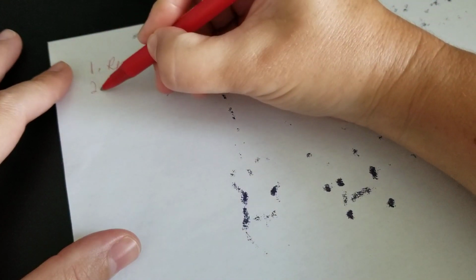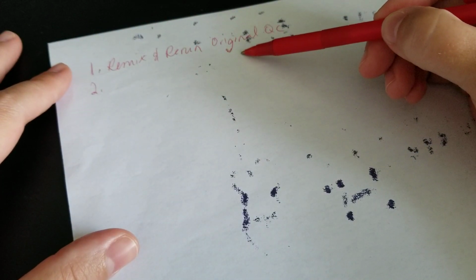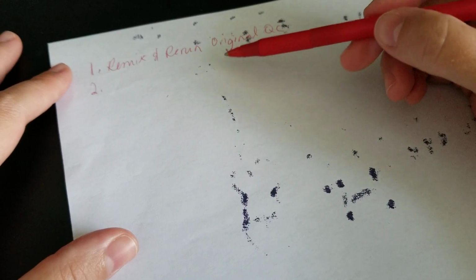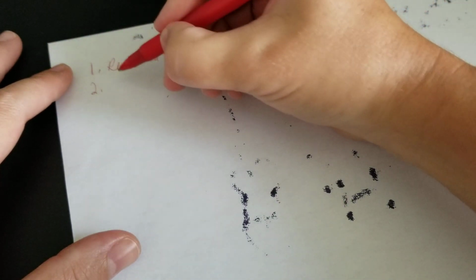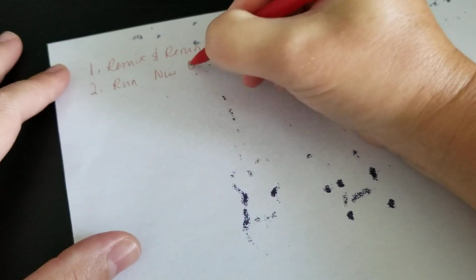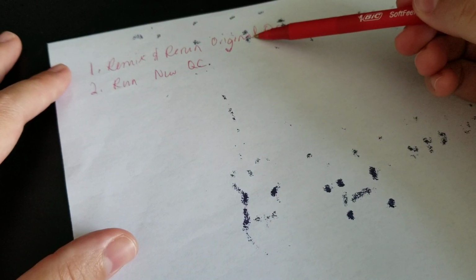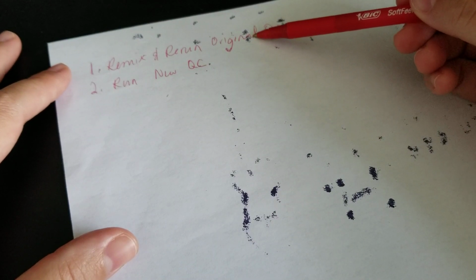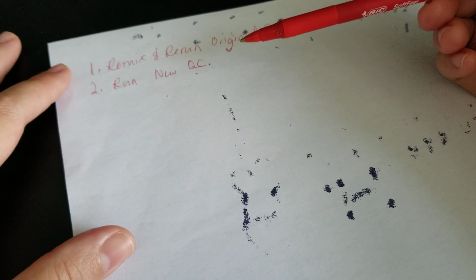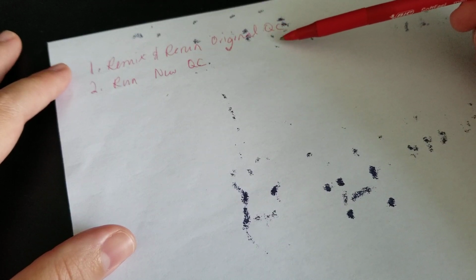The second thing you would do is, if you made sure that this QC was fine and you remixed and ran it, the next thing you would do is get a new QC. So run new QC. All right, because evidently it might be a QC problem. You're hoping. Okay, so the thing that you're always trying to do first is make sure that your consumables, the easiest things to fix, are the problem.